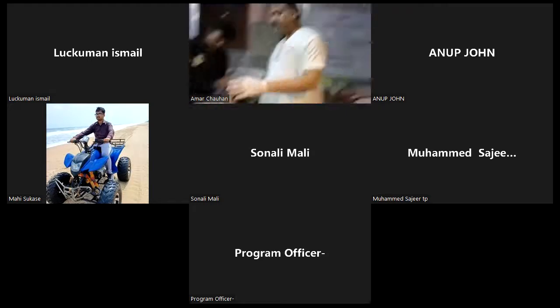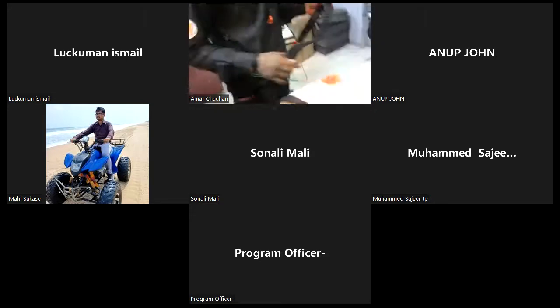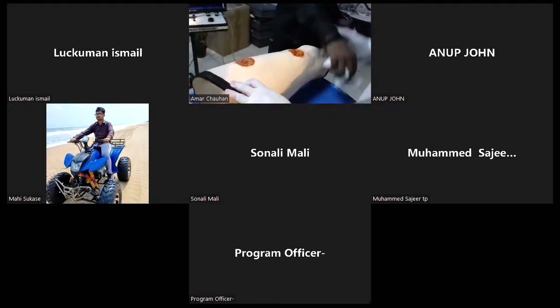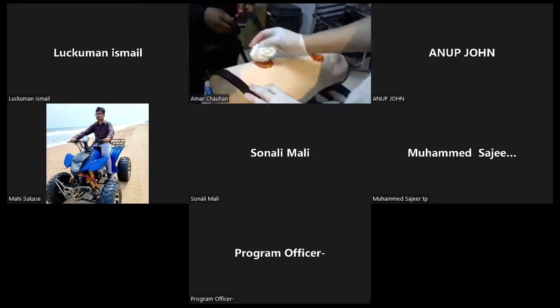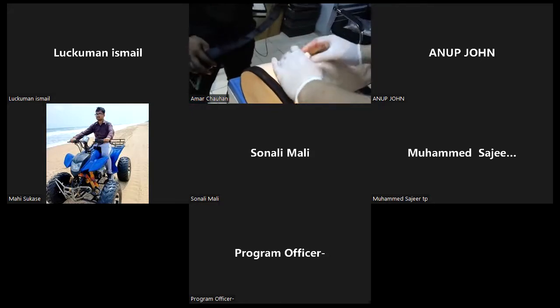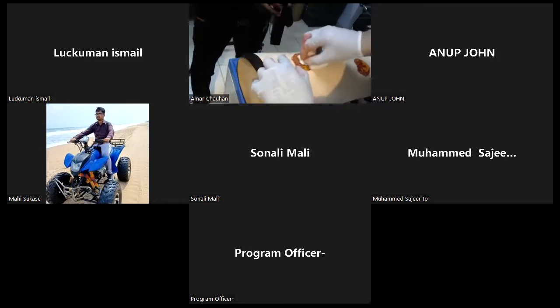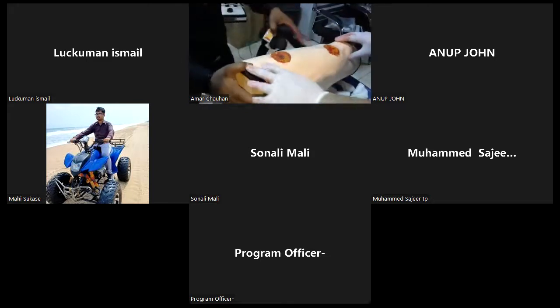So now this is our stop the bleed mannequin. Basically, there are three scenarios. The first scenario is that when the patient has a simple wound, you just keep the wound pressed. If it is a deep wound, you have to do the packing. The third scenario is when the patient is having profuse bleeding or arterial bleeding.